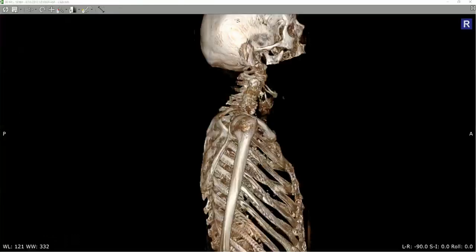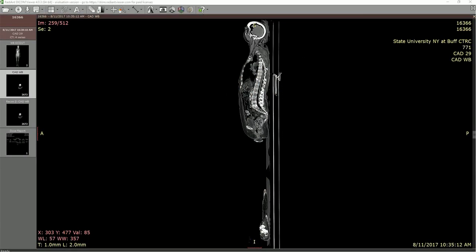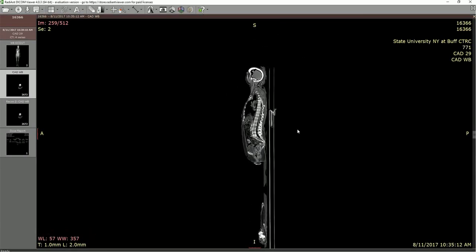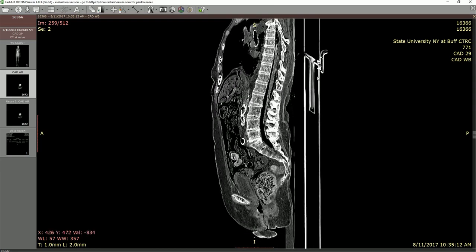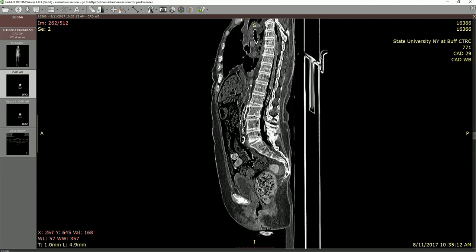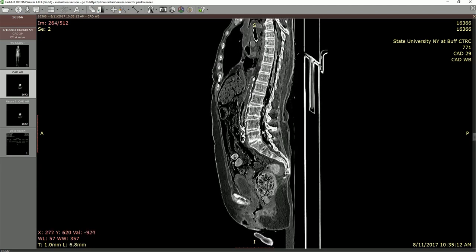One last view is the sagittal view. It's important to remember that we've got this mostly in the sagittal perspective but there is a bit of an oblique angle — the head of the humerus is sitting a little more anteriorly than expected because the person is slightly protracted in this position. This would pretty much be a mid-sagittal view. If we zoom in, we get a nice view of the vertebrae, the vertebral canal, and the spinal cord — that's pretty much the termination point. Scrolling back and forth, you can see a little bit of the cauda equina moving up and down.